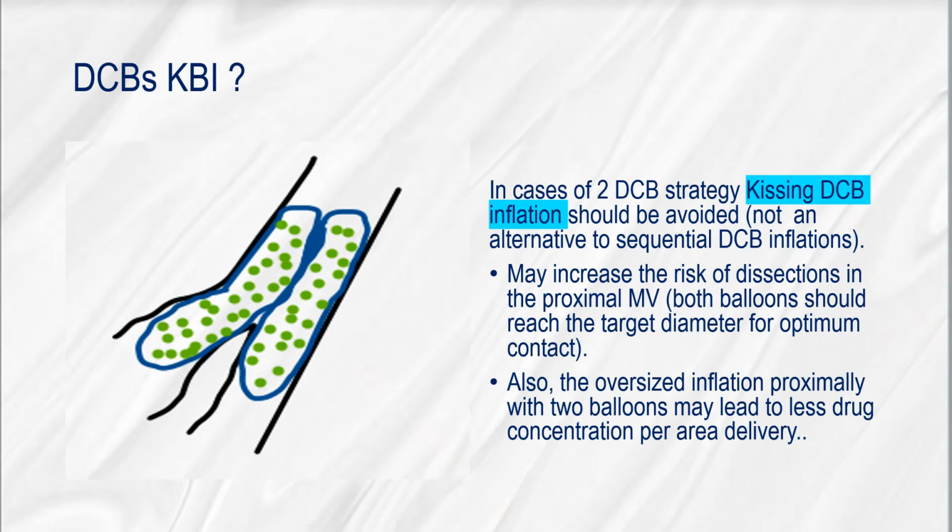What about drug-coated balloon kissing balloon inflations? This strategy should be avoided, not an alternative to sequential drug-coated balloon inflations. It may increase the risk of dissections in the proximal main vessel. Both balloons should reach the target diameter for optimum contact.